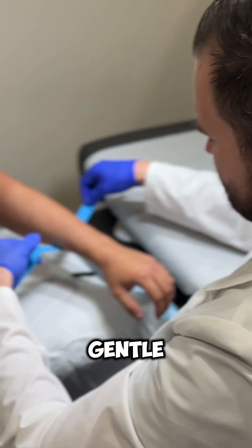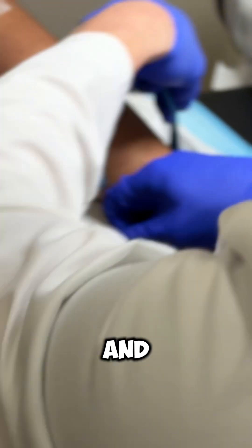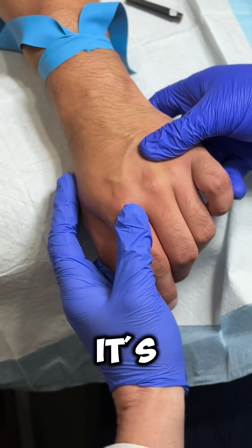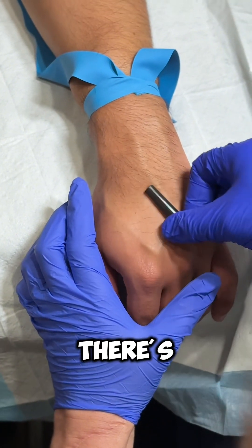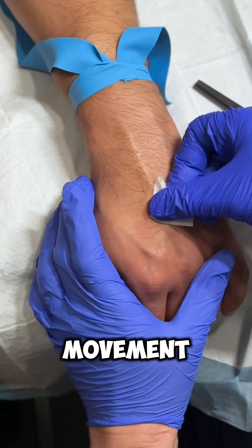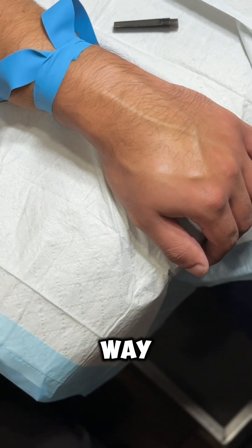It's going to be a little more sensitive but I'll be gentle. Wrap it tight, make it very nice without rolling. Some people just let it go — you really need to put pressure on there. Position is important: if the hand is just sitting flat it's not good. I have the patient pull back so it pops more. If I put the needle in at a flat angle it's just going to move out of the way — that's a big problem. So I wipe it, and look how much it rolls — this is your typical rolling vein.